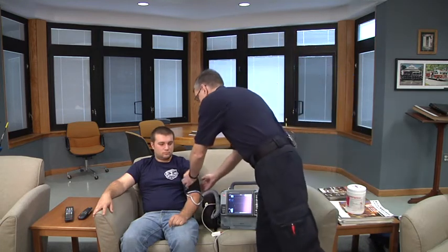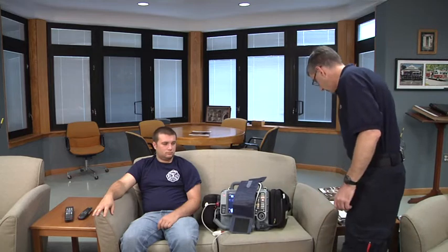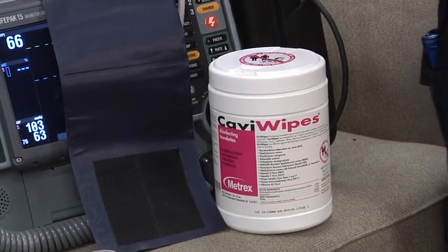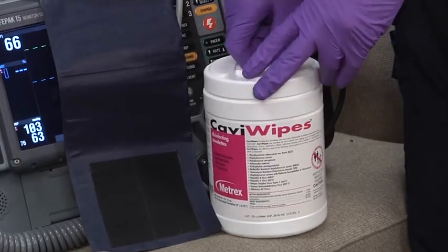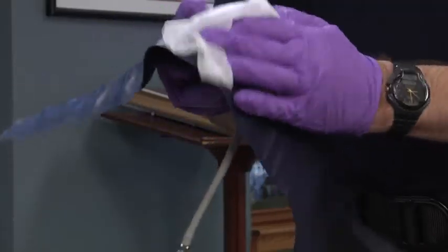Lastly, we're finished using equipment on the patient. An important part of taking care of your equipment and not contaminating patients from one to the next is to decontaminate the equipment. Before you put a device like this away, you're going to use a cleaning or disinfectant wipe to clean the blood pressure cuff and cables. Because we're using a wipe that is a quaternary ammonia compound — the kind the EPA advises for cleaning medical equipment — we're going to put gloves on. Gloves were not necessary to take blood pressure on a patient; gloves are probably excessively used by EMS providers.